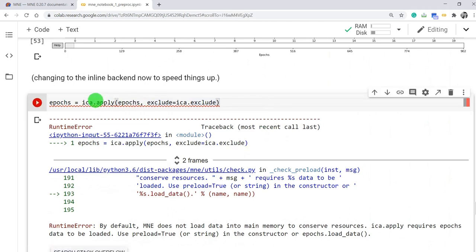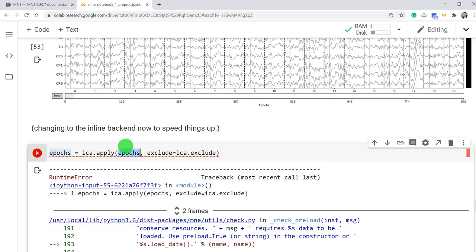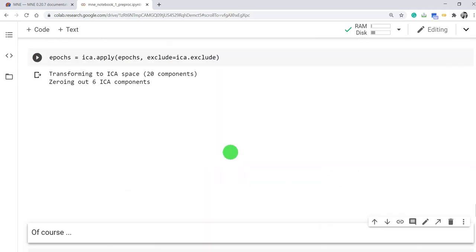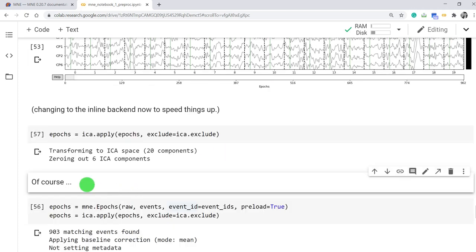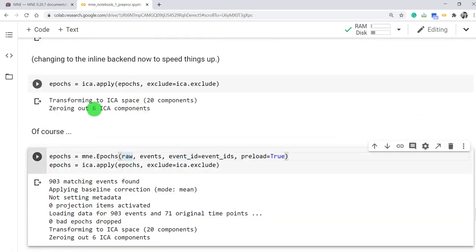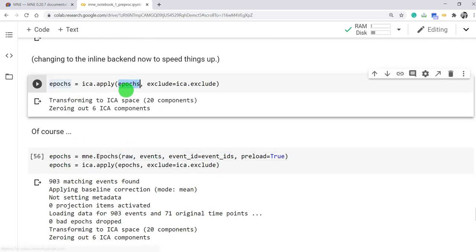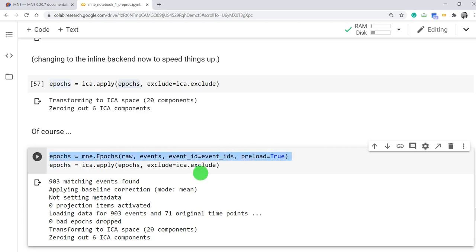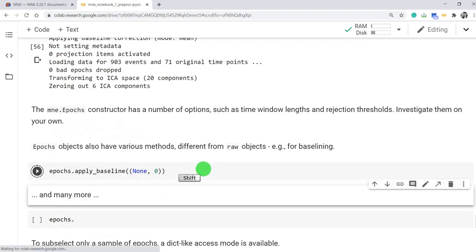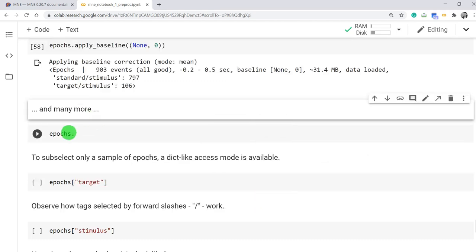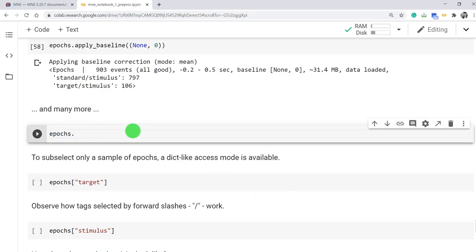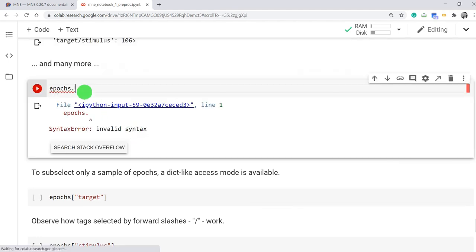Let's try to apply ICA on this epoch or segmented data by excluding those components we defined earlier. So if you do this, then we can apply ICA. Basically, first before applying epoch, so we need to make sure that preload is true. And then you can apply ICA. Then let's try to apply some baseline and then try to explore the epoch object.